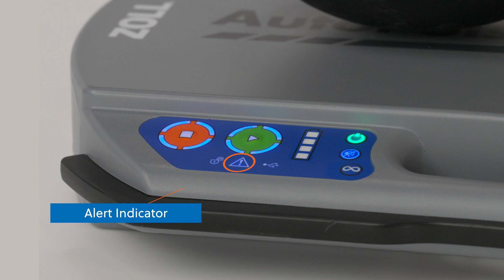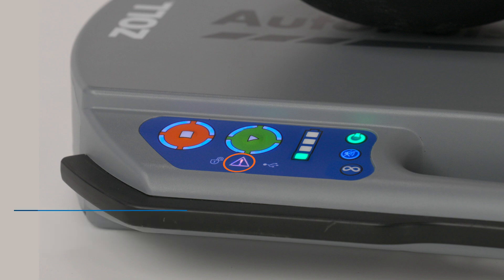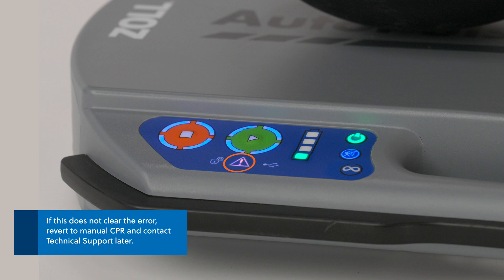Next on the user control panel is the alert indicator. This alerts users to important AutoPulse NXT functions. When illuminated yellow, continue to use the platform and contact technical support later. When the alert indicator is flashing and the battery charge status shows one bar, replace the battery. If the alert indicator is flashing but the battery charge status is not flashing, turn the device off and then turn it on again. If this does not clear the error, revert to manual CPR and contact technical support later.